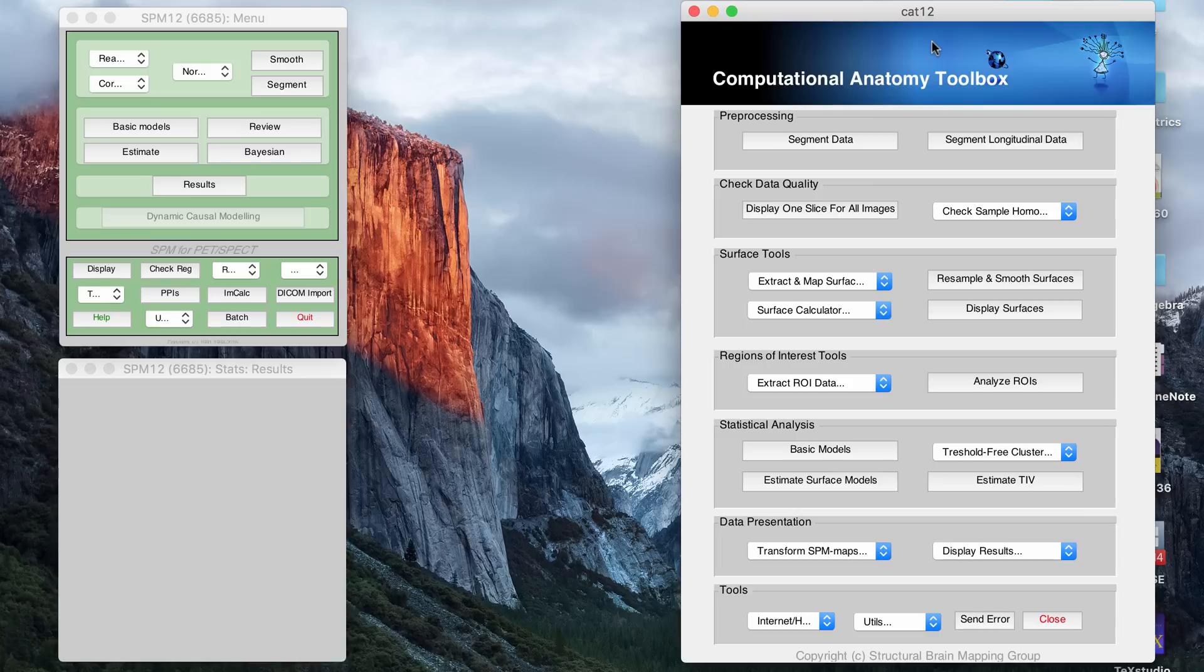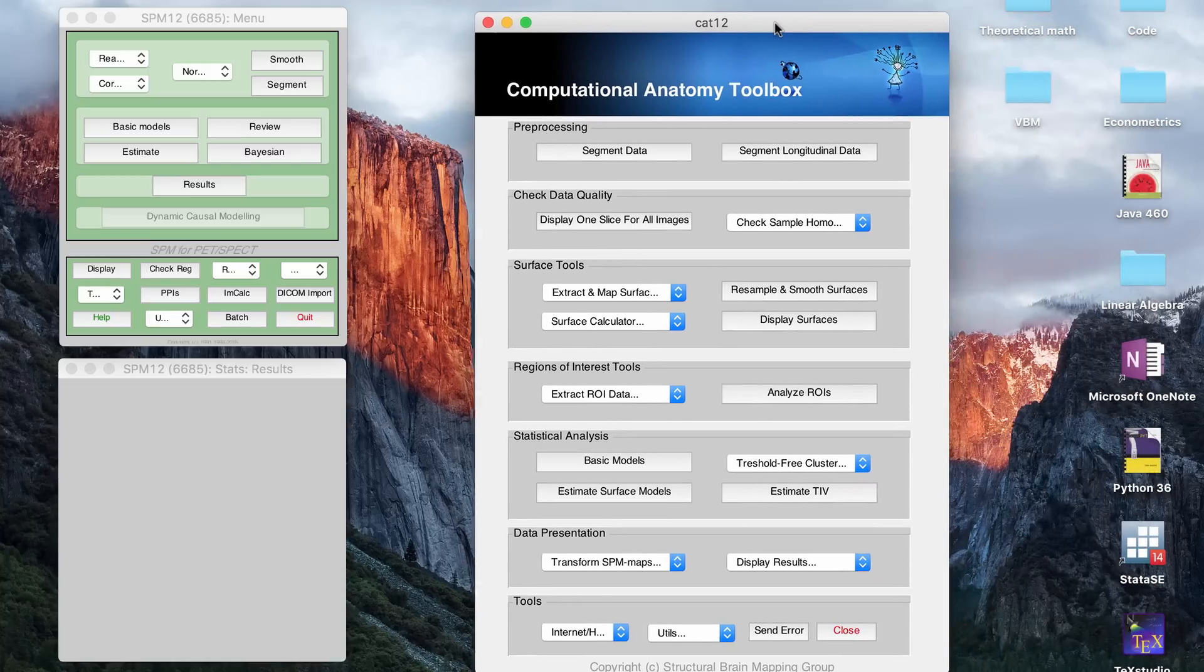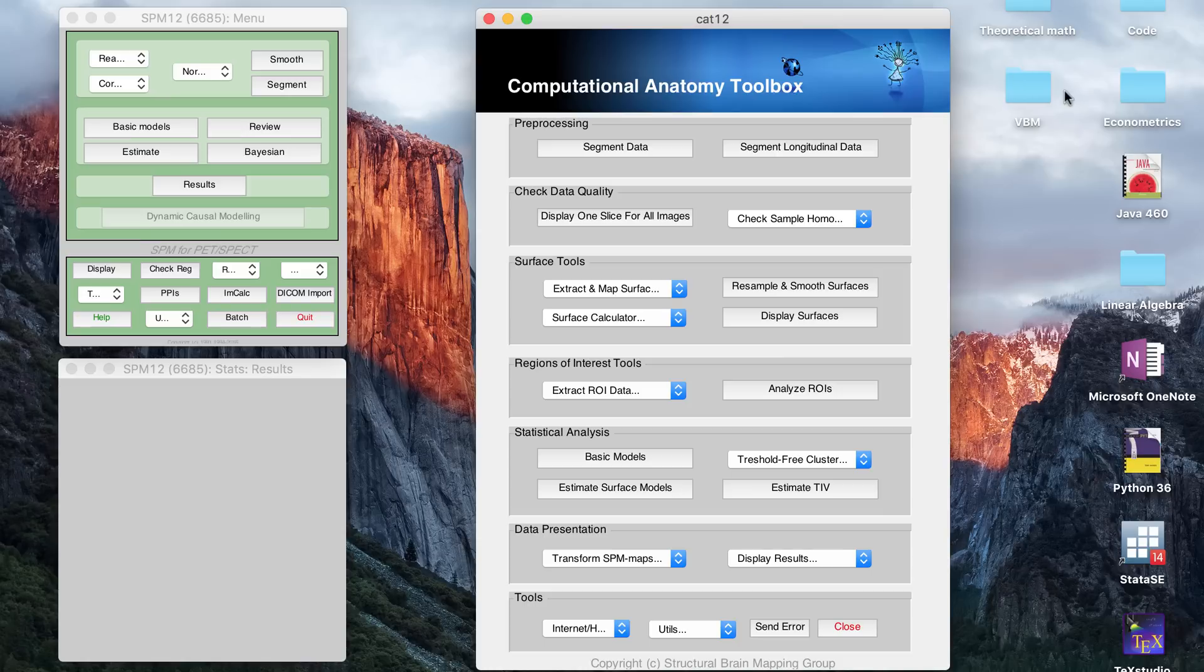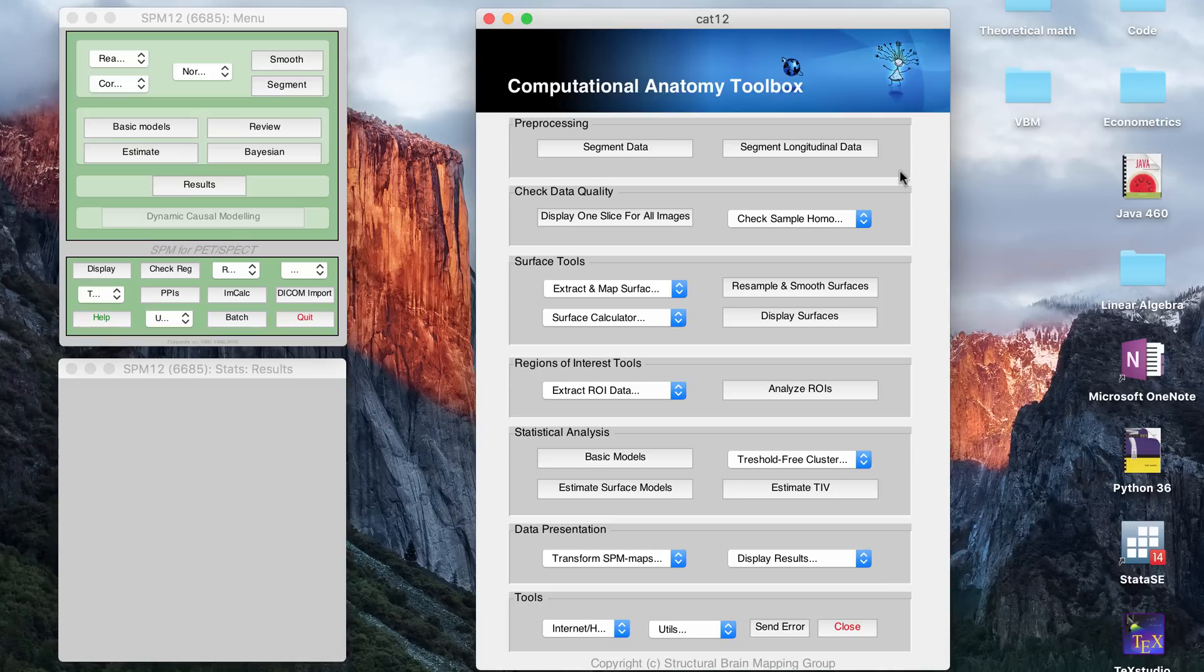And also, to make the video a little bit shorter, I have all my results in a VBM folder, so I'm not really going to run the examples. Just to make it quicker, I'll pretend I'm running them and then just show you the results at the end.